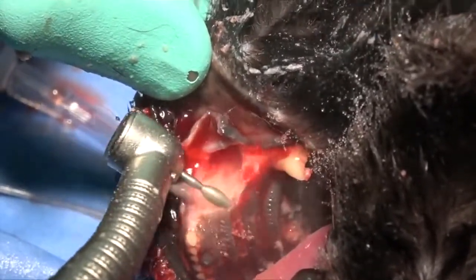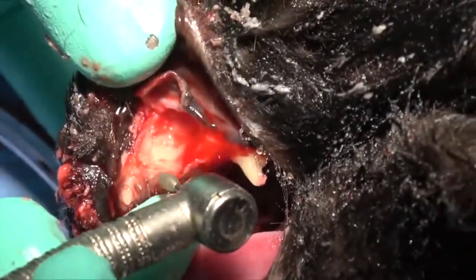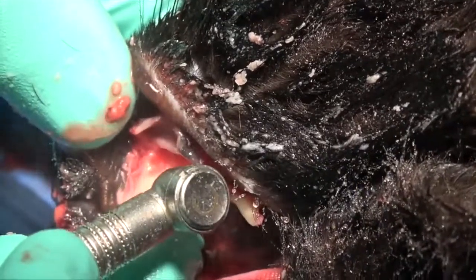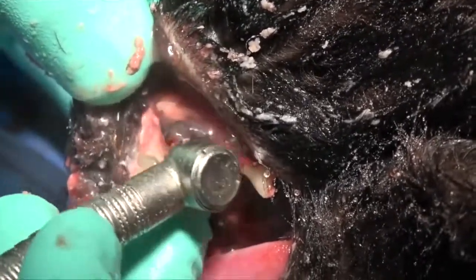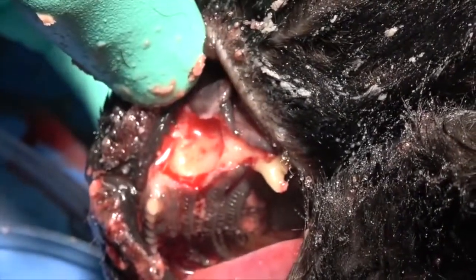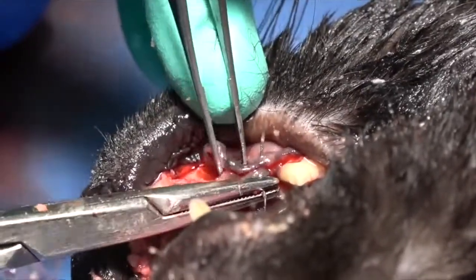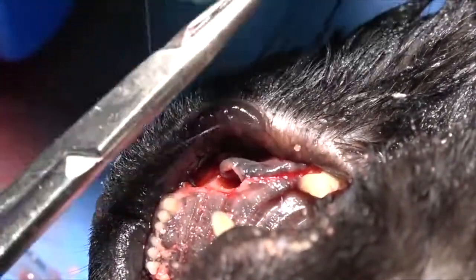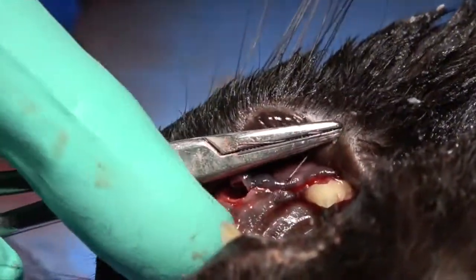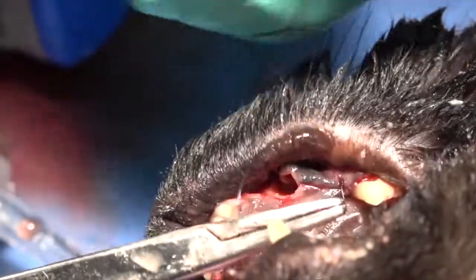We're getting up underneath that palatal mucosa with that football burr, just smoothing that out. At the same time, we're creating a space so that we can pass the suture into the palatal mucosa from the vestibular mucosa. The burr will actually eliminate the fimbriated edge of the mucosa if it's inflamed without hurting the deeper, healthy underlying mucosa on the palatal side — a very nice technique that creates a lot of efficiency and reduces your time significantly.